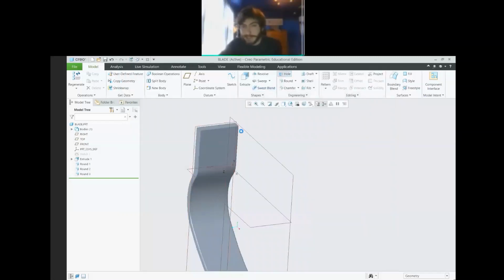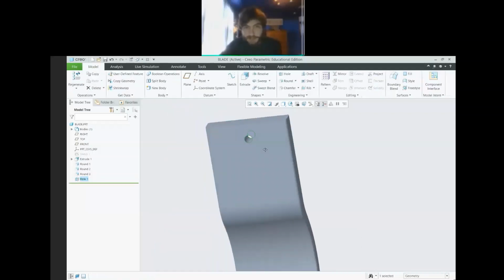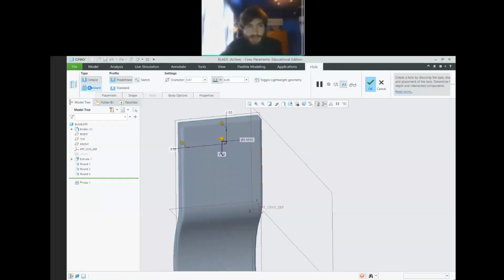So put a hole, we'll click this face, and you see we get these 2 little red handles. So we'll drag one to this top face, one to this face on the left. And so you see, once we did that, we got extra dimensions, right? We have this 1 up here. We have this whatever guy up here. So we made it 5 inches across. So we'll make that. So we get it halfway, right? Okay, so then what we're going to do is we are going to create a standard hole.